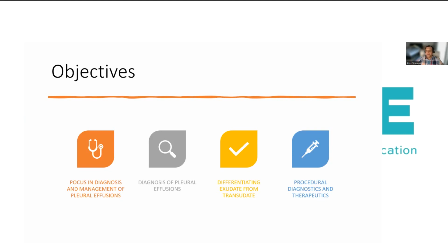Now, the use of chest drains is not without complications, as we will discuss today. And one of the areas of emphasis that has recently come out is that if you use lung ultrasound in trying to manage pleural effusions, not only are you able to diagnose and manage them better, but you can actually reduce the rate of complications that you see.